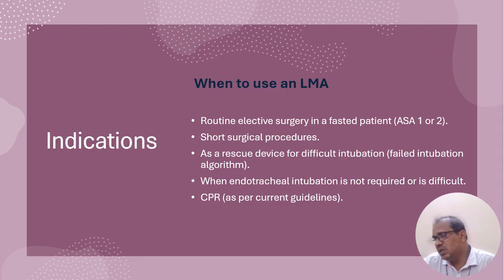When we use the LMA, we can perform short anesthesia procedures, and in children we usually use the LMA. But we have to keep in mind that the patient must be grade 1 or 2, not grade 3 or another problematic patient.